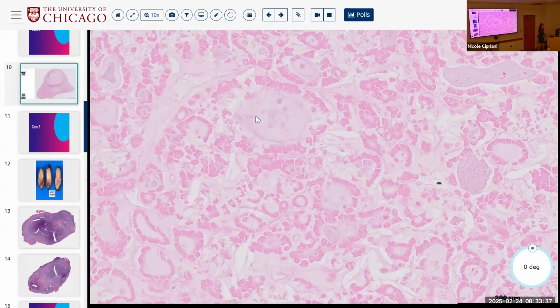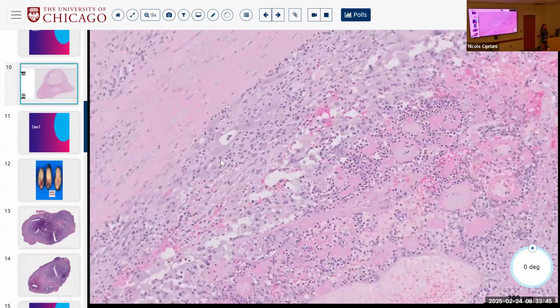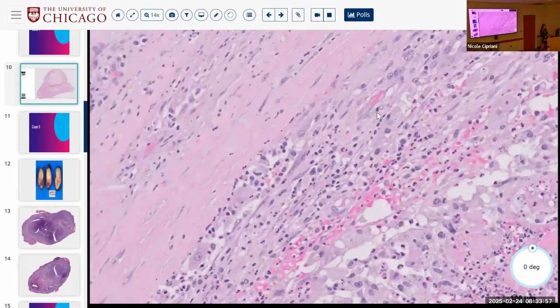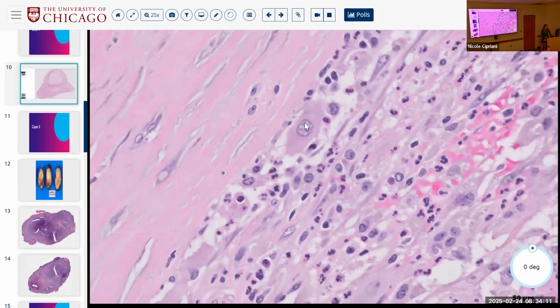I don't even know. But sometimes if you're lucky, you can see a peripheral rim of oncocytes. Maybe these are a few here that you were pointing out with these large nuclei with prominent nucleoli. There's a cell border there. So you probably have a few oncocytes, and if you wanted, you could throw a keratin or a Pax8 on there to see. Although the Pax8 is going to pick up your lymphocytes, so just be careful. Maybe a keratin or a TTF1 would be better in the context of inflammation. But these are probably some residual viable cells.